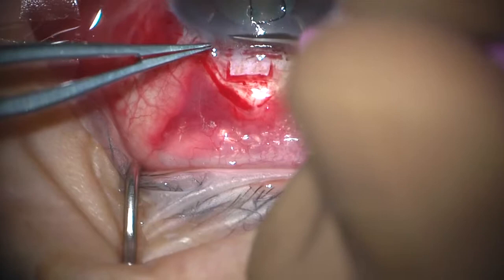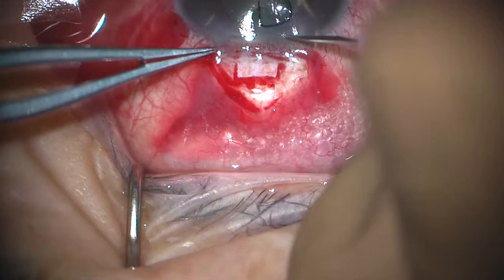So I'm going to make my corneal grooves, and I'm going to make them at the end of the radial incision. So at the end of the radial incision, the groove, same on this side.